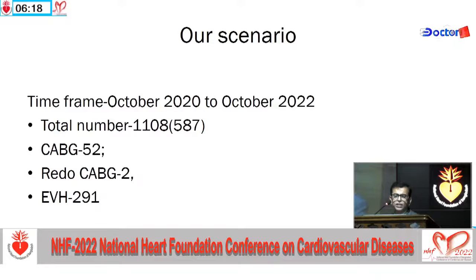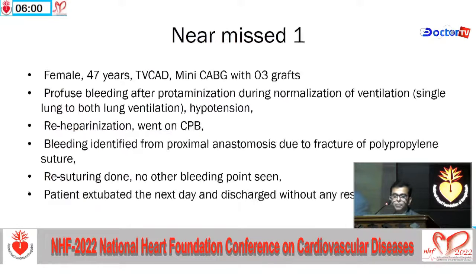We did 291 EVH cases, endoscopic vein harvesting, because we adopted it only this January. In 10 months we have 291 EVH cases. Due to the Ukraine war and others, nowadays all those disposables are not available. It is difficult to import as well. We can share our 1 or 2 cases where we got some difficulties.